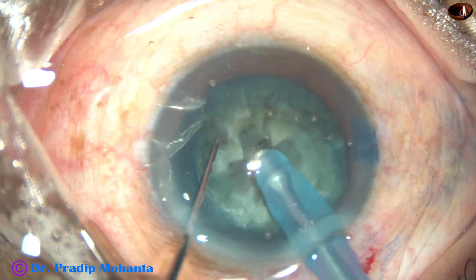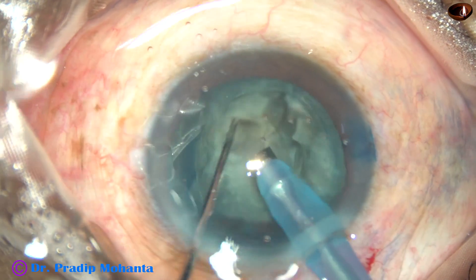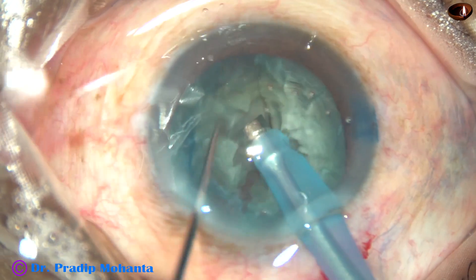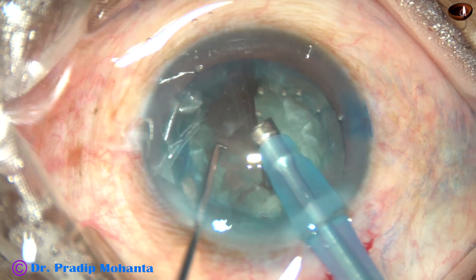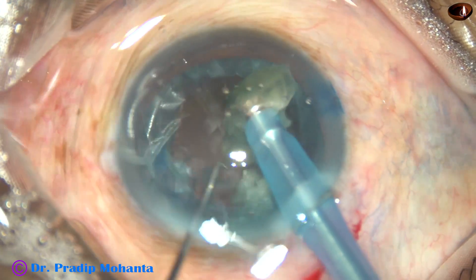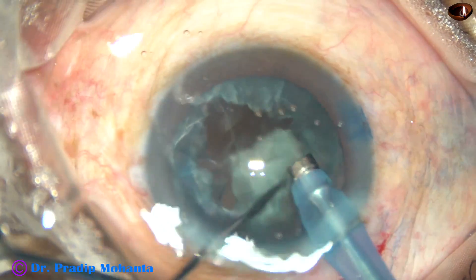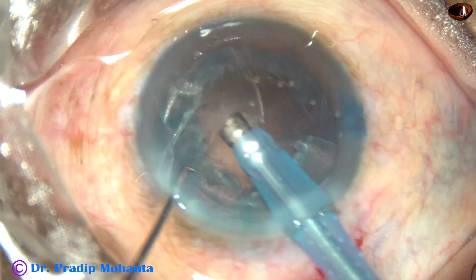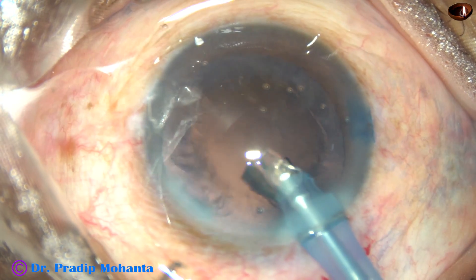Once you are sure that you are at the right depth, just use opposite forces with two instruments — one is the FACO tip and the other is your chopper — and divide the nucleus into fragments. Now go to FACO 2 mode. In this machine I have used 350 mmHg vacuum and 35 ml per minute flow rate; this is the Alcon Infiniti. Every machine is different, and you have to ask your senior what vacuum and flow rate to start with. You should start with safe parameters.